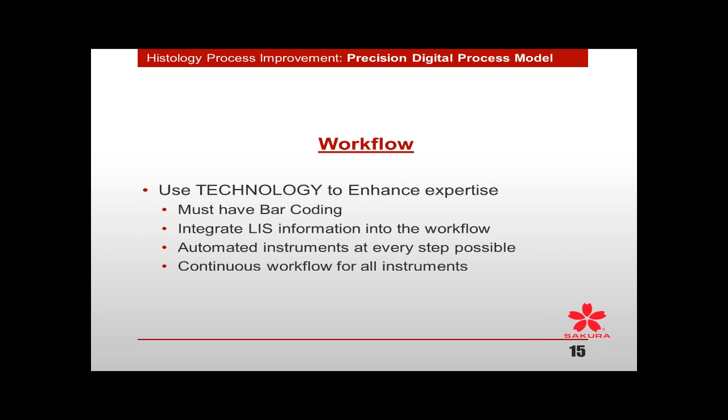You have to integrate your LIS information into the workflow as soon as possible. Most of us have been used to the LIS being a little bit at accessioning and then maybe a little bit with our IHC stainers, but that's near the middle to the end of the process. Again, you really have to find a way to integrate this whole information workflow into the whole integrated workflow of histology.